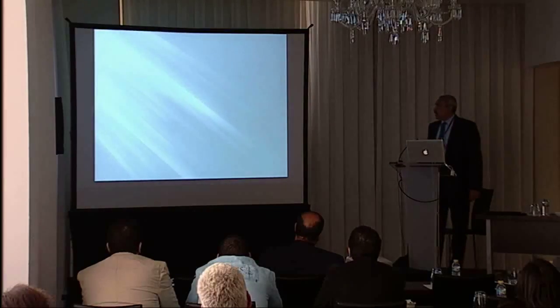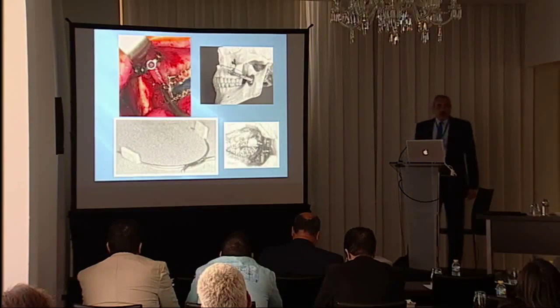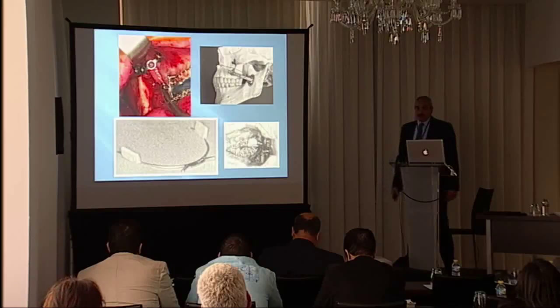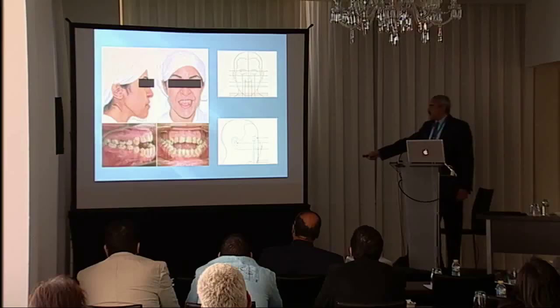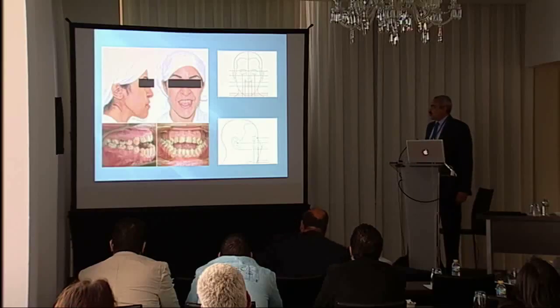And along the years, many of what we call condylar repositioning or condylar positioning devices were introduced with actually no more value than the manual repositioning, so most of us were not using them. Now we're doing that computer guided. This is, for example, a case. This case went through bimaxillary surgeries, but we'll concentrate now on the mandible.